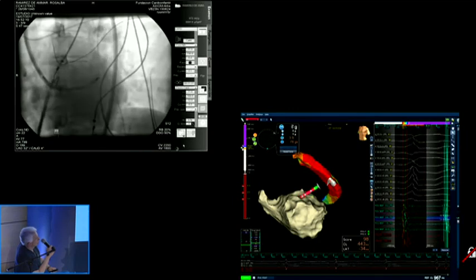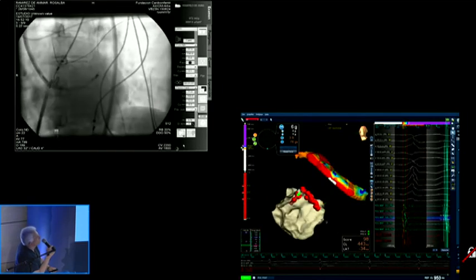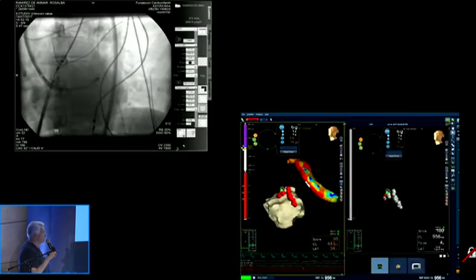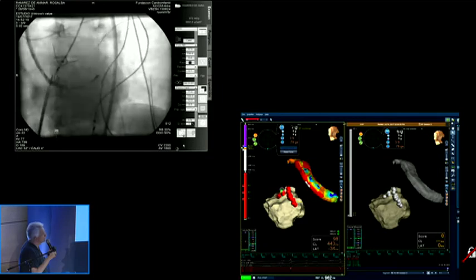Can you show when we did the positioning of the catheter, the placement of the catheter? And what we did here was to try and look for the best place, but it was very difficult because there were many chordae tendineae. The first lesions were at 35 milliseconds, but then at the end we managed to lower the catheter and place it basal in the area.